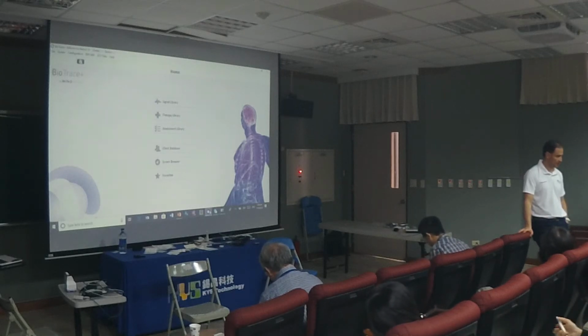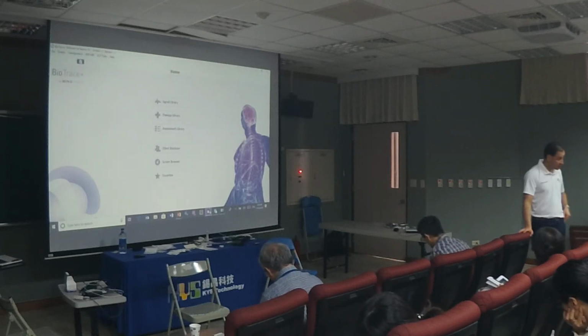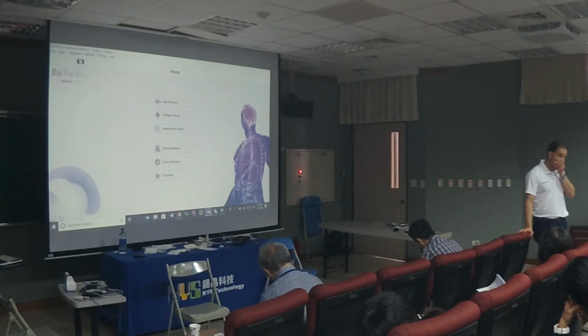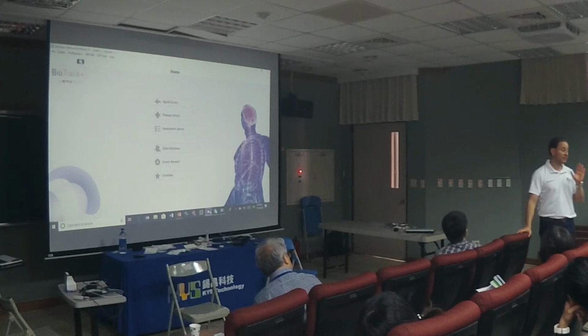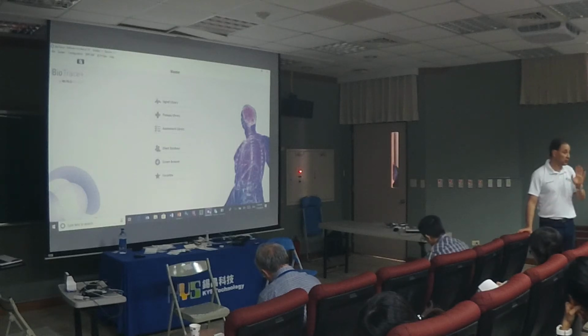No more, no less. There's people who like to do 1.5 hours. I think that's too much. I think 90 minutes of neurofeedback is too much for any person. Okay? So my recommendation is that you do between 30 minutes and 45 minutes. Now, 45 minutes of training. That's not counting the saying hello, the hooking up the client, and asking the questions. So I do 45 minutes of actual training. Right? The minimum that you're going to need is 30 minutes. So I recommend that you go 30 to 45 minutes.